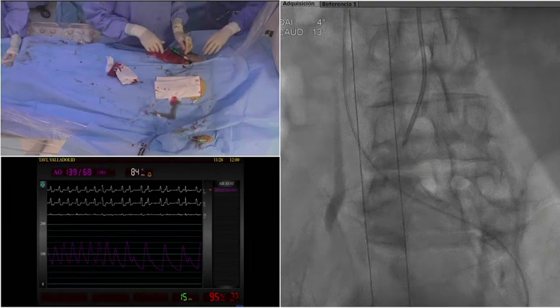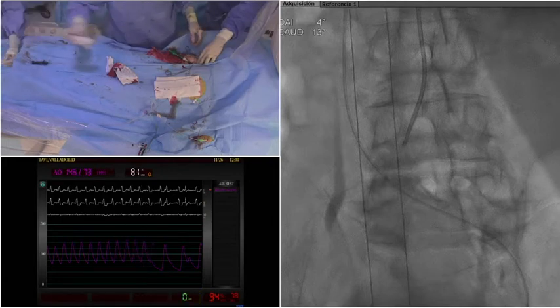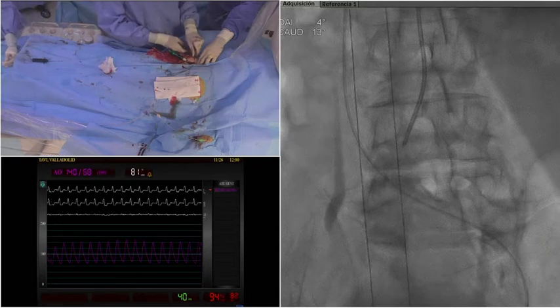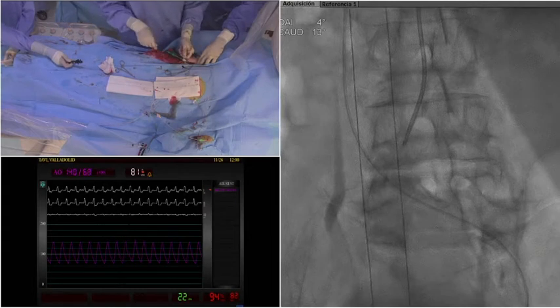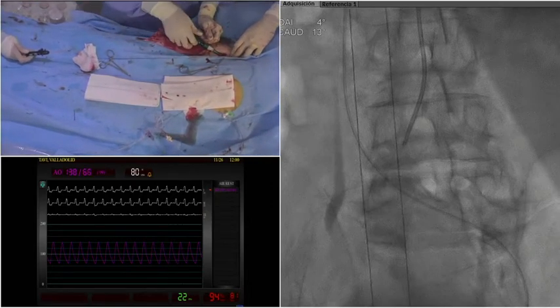But it has been a few years now that we have been using the proglides. We have also tried Manta with intermediate results. I think we use it also in more challenging and calcified cases. But our preferred strategy is the two proglides. So I'm going to... two proglides.